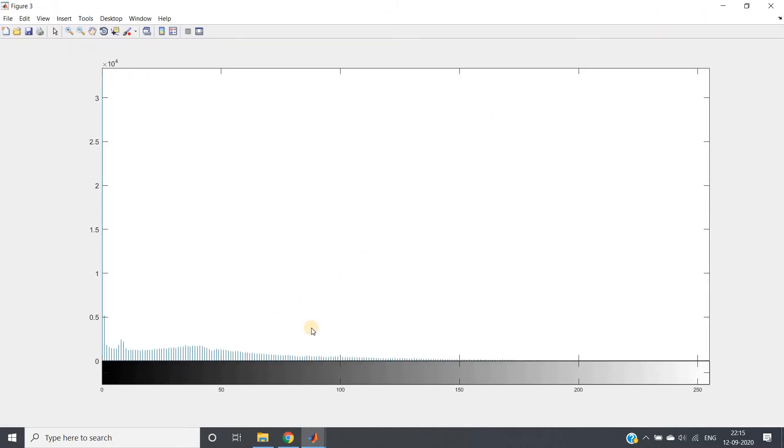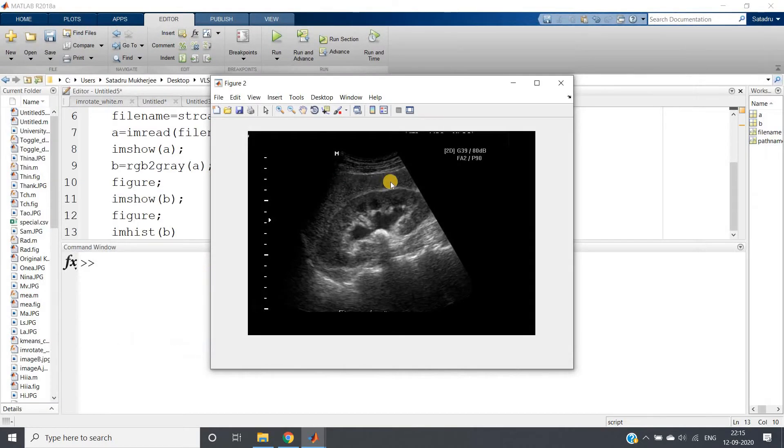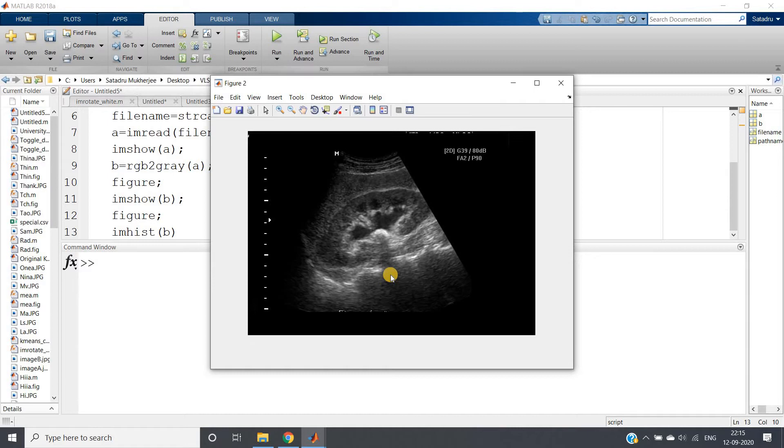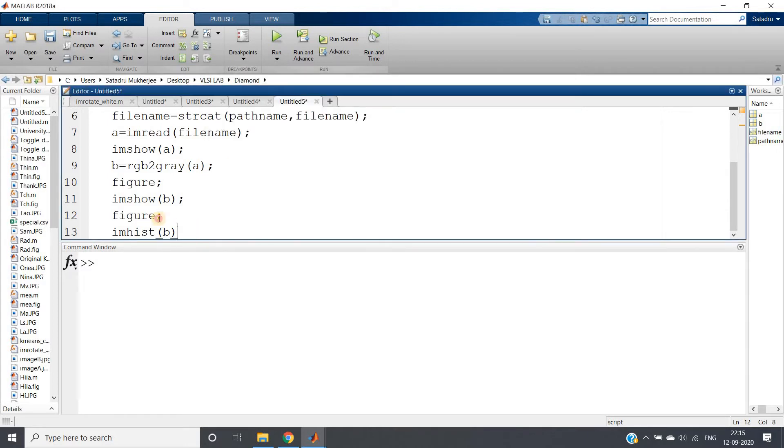Why I am checking the histogram? Just to verify whether we can apply global thresholding or not. So here we are getting this kind of histogram. You can see it is not at all bimodal. There is no lobe in the lower part and the brighter part. So our global thresholding is going to fail. This time what we can do, we can apply adaptive thresholding and another way is that from the pixel information we can try to get the particular threshold value using kind of trial and error method.